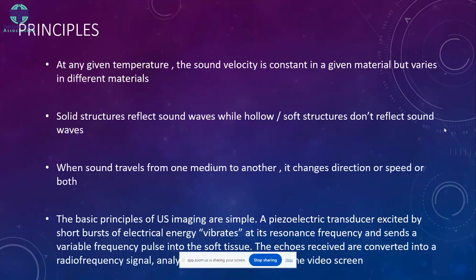Solid structures usually reflect sound waves, while hollow or soft structures don't reflect sound waves. It is transmitted without any interference. And when sound travels from one medium to another, it either changes direction or speed or both of these factors.